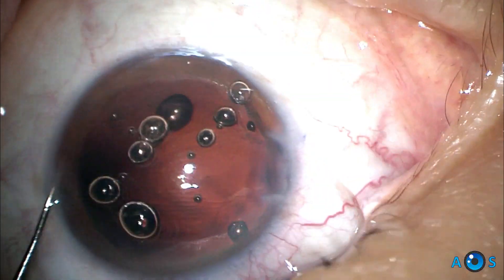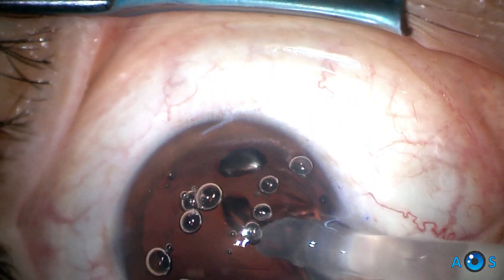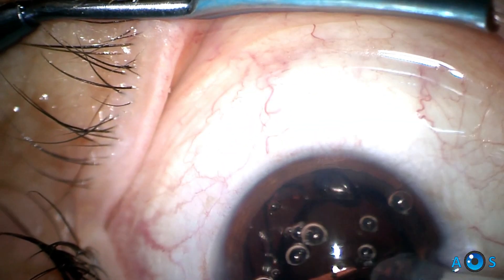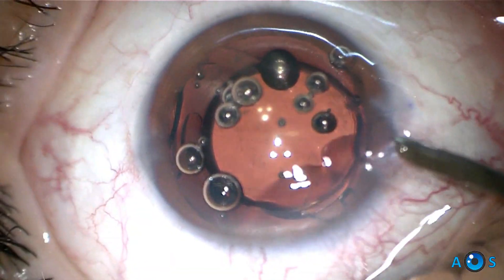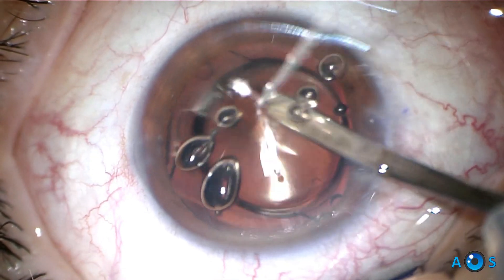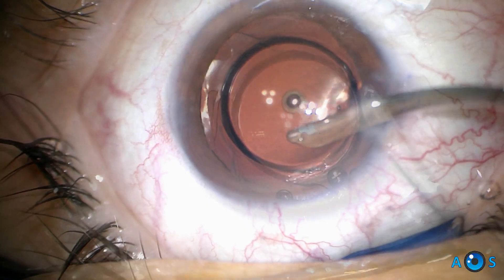The Pac-Man IOL explant surgical technique is complete. Now we implant the newly calculated IOL — the same preloaded monofocal model is chosen and implanted in the capsular bag. A passive irrigation-aspiration cannula is used to completely remove the OVD from the anterior chamber.